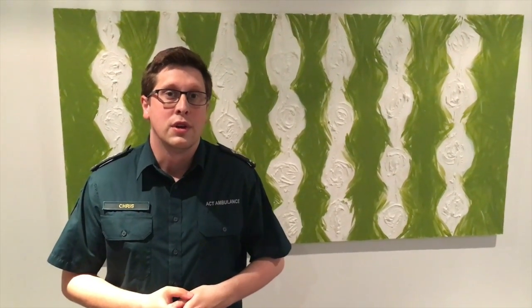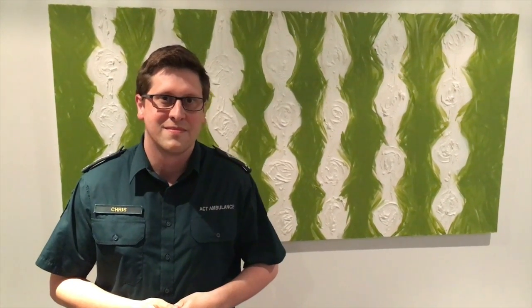Hi, I'm Chris and this is a short video about intraosseous access. Here in the ACT Ambulance Service we use the EZIO drill system, which I'm demonstrating today.